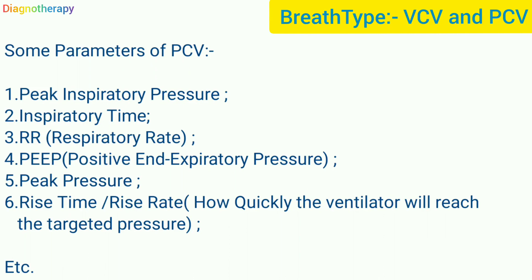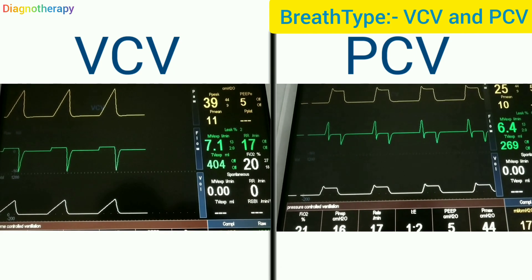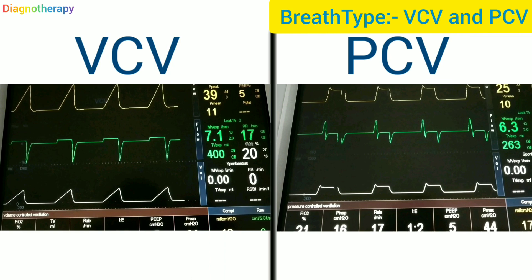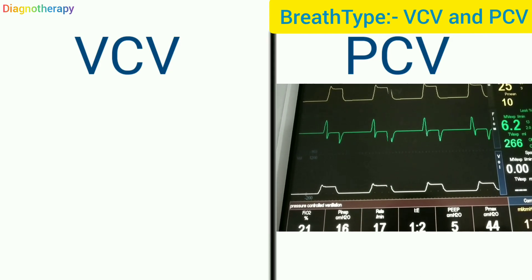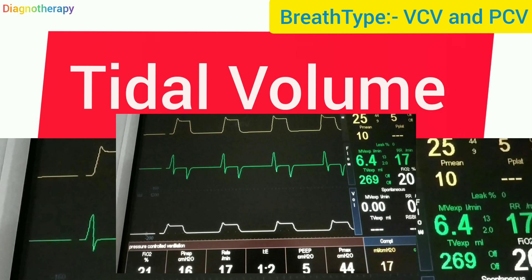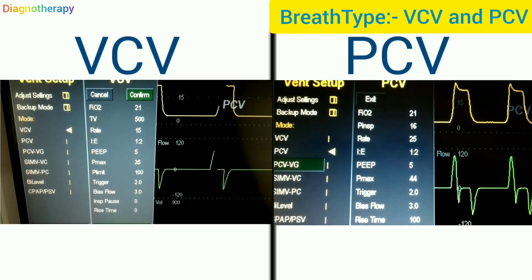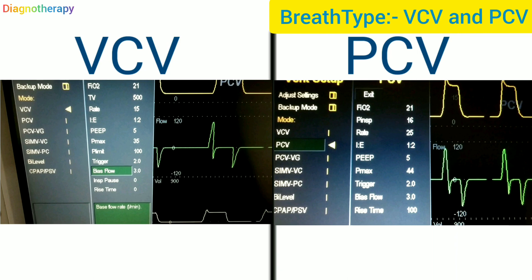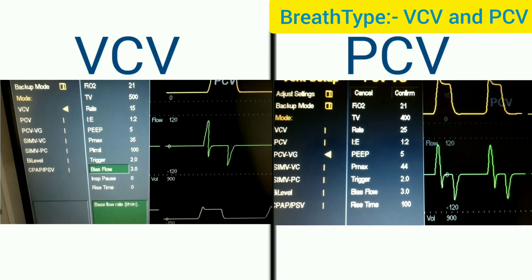Now let's look at the ventilator screens. In volume control ventilation, the ventilator ensures that the set volume is delivered to the patient and continuously monitors whether those settings have been achieved. In pressure control ventilation, the tidal volume shown is the maximum volume of air delivered to the lung before the maximum pressure value is reached. On the left screen is volume control ventilation and on the right is pressure control ventilation. In VCV, tidal volume is the key setting; in PCV, P-max is the main parameter.